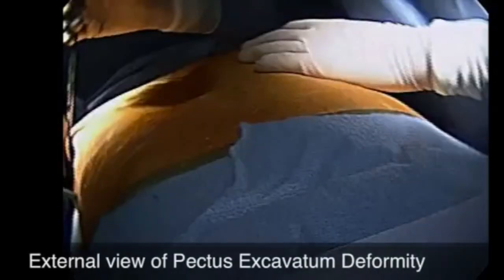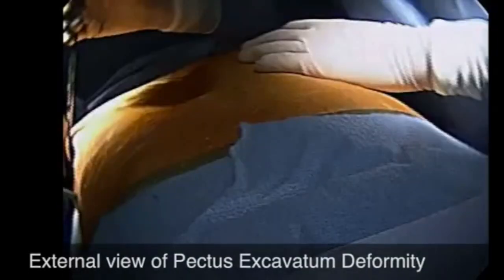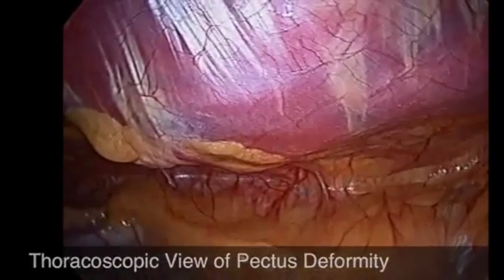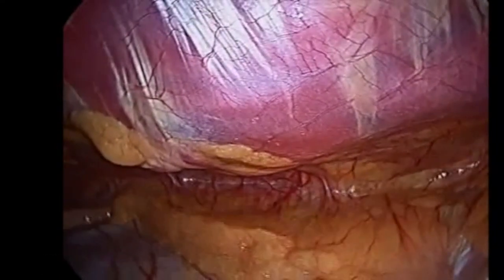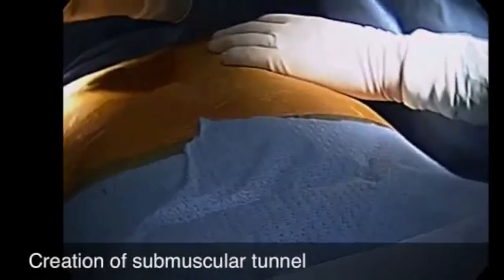The procedure was begun with right-sided thoracoscopy via a 5 millimeter port and a 5 millimeter 30-degree scope. The internal view of the pectus excavatum deformity can be seen here.